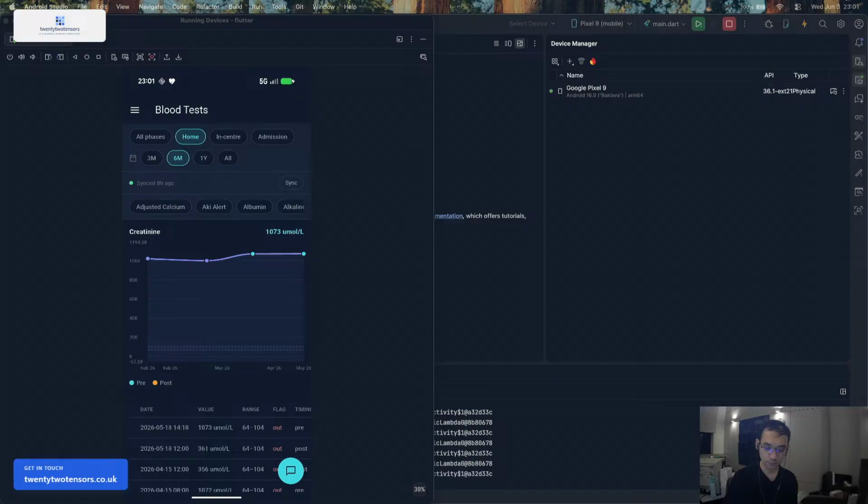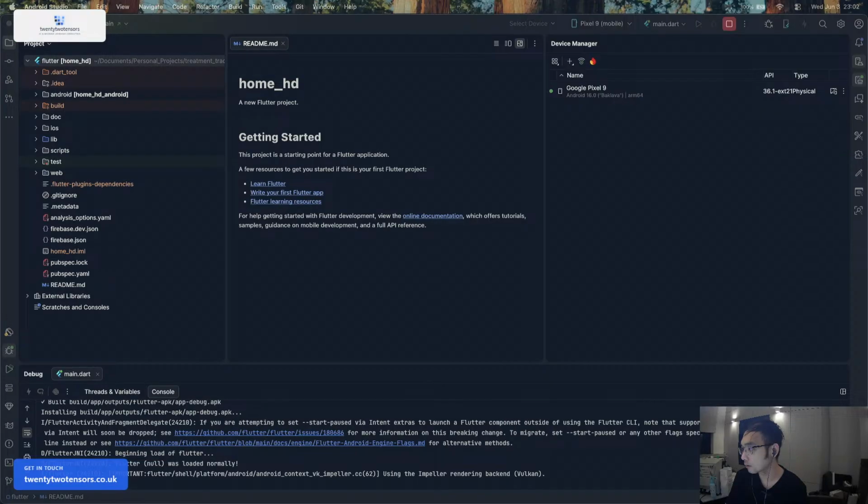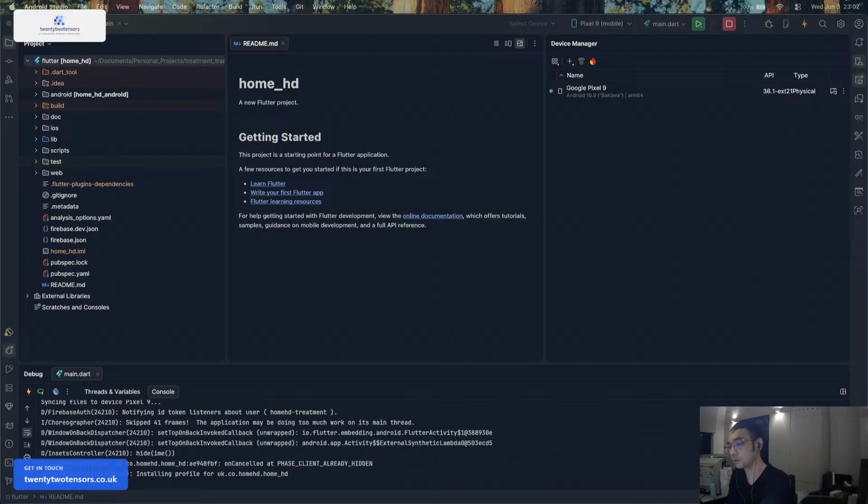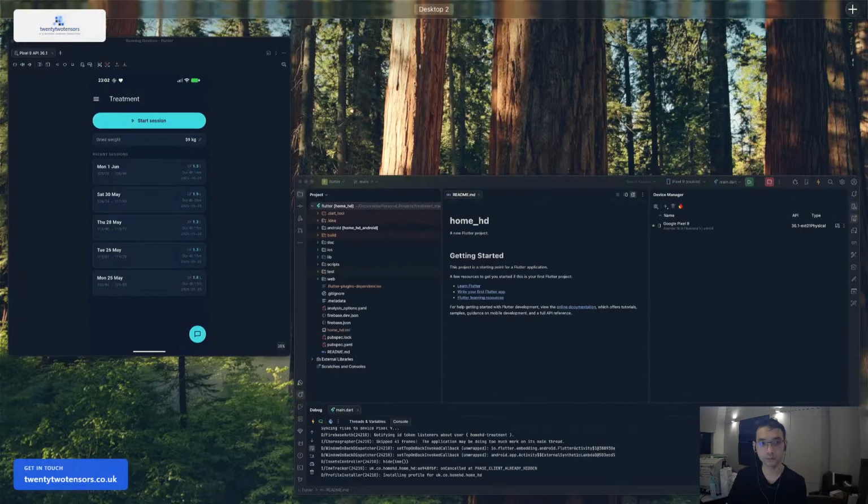What I'm doing now is trying to make the AI more usable.